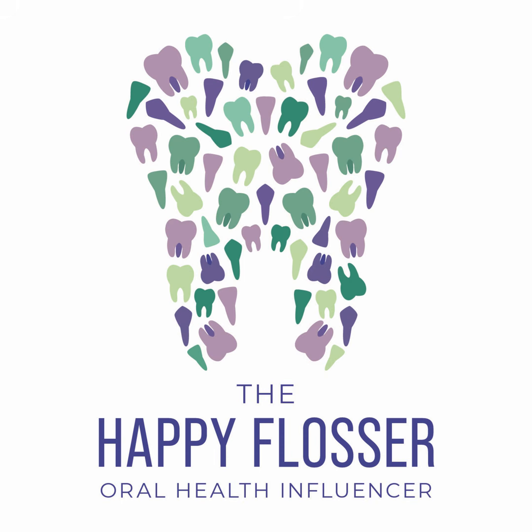There's kV and mA. The kV controls the quality of the penetrating power of the X-ray, and this affects the density. The mA controls the quantity of the number of X-rays. So if you change the mA, you'll change the number of X-rays produced, which will also change the density.